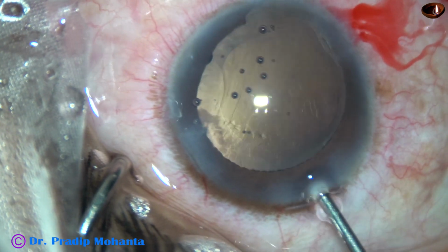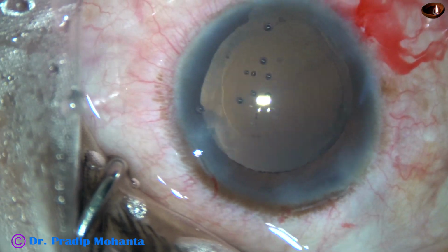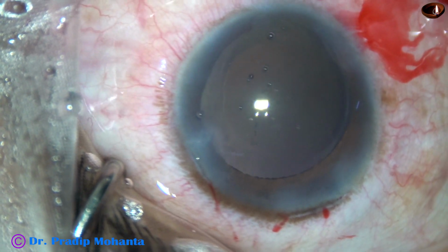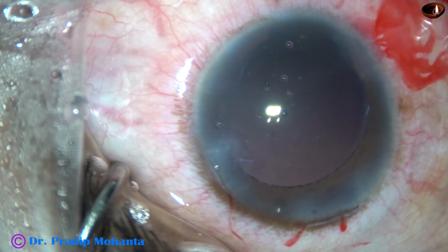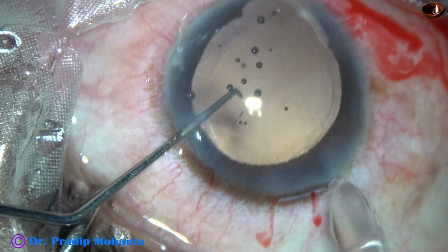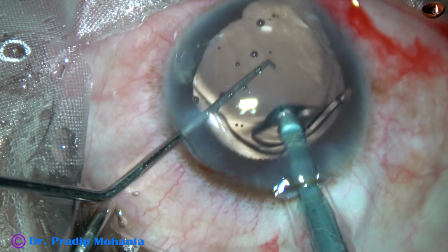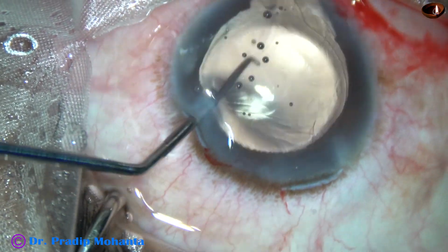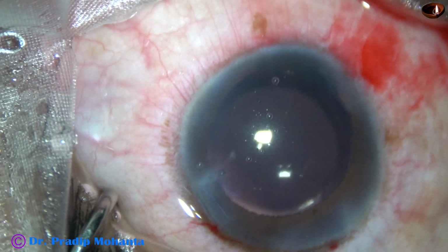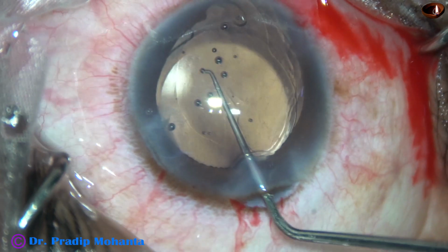Now fill the anterior chamber and the capsular bag again with visco, and then implant a hydrophilic acrylic single piece intraocular lens in the capsular bag. The patient could not afford a hydrophobic multi-piece intraocular lens. The haptic is placed at 6 o'clock to give some amount of support to the dehiscent area of the zonule.